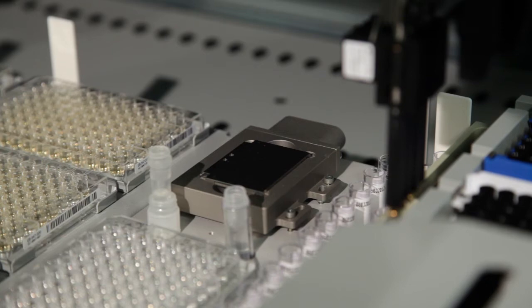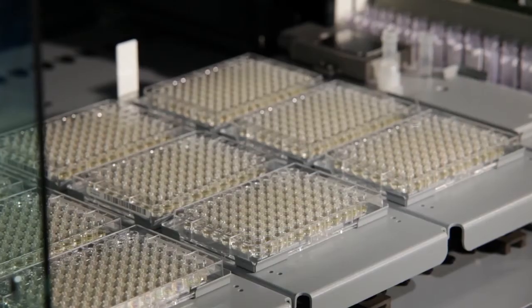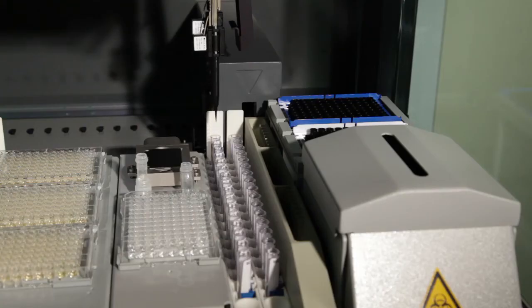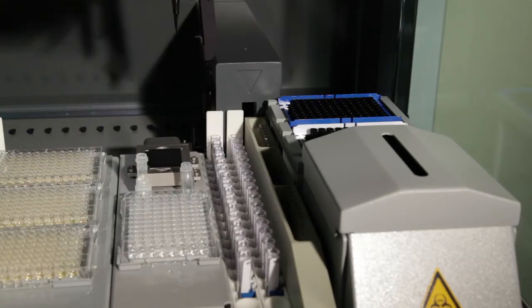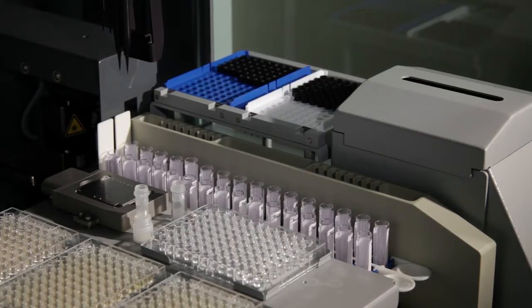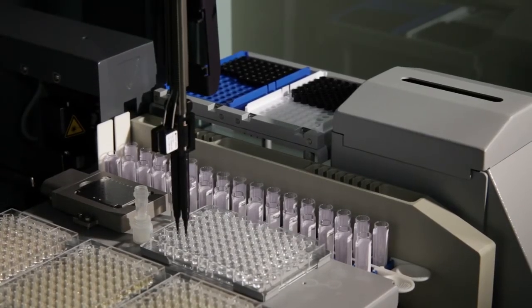Secondly, the allocation of the samples to the MALDI-TOF target and to the Micronaut AST plates is performed. After homogenization, an aliquot of the sample is spotted on the MALDI-TOF target and is also used for the inoculum preparation of the AST testing.